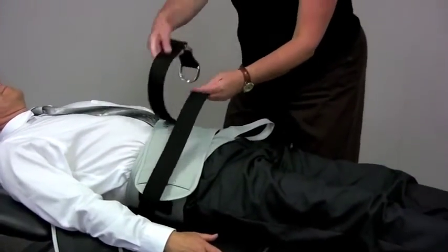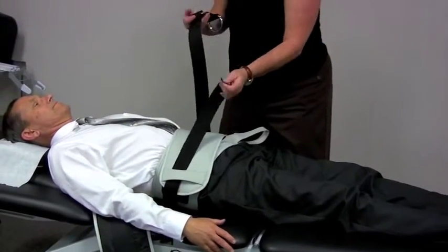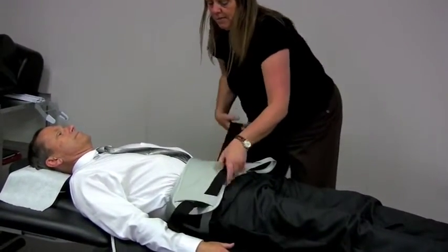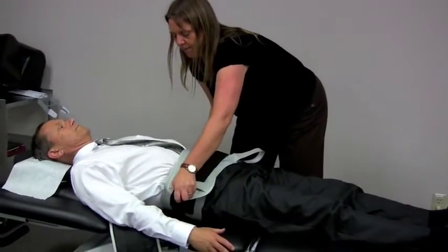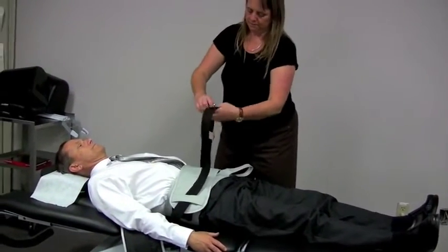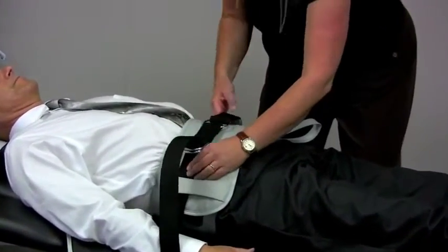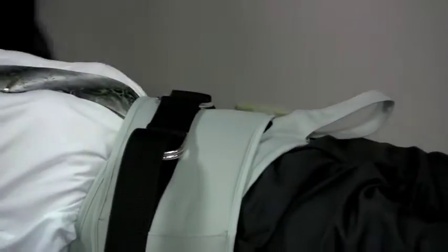And then this next part, it's optional to place this part through the slot right there. You don't have to do that. And I don't want to jostle him too much, so got to be careful thinking about patients who have this done, as they are going to be in perhaps a back spasm or have some disc involvement. And I'm going to go through this buckle, and my goal is to have this ring in the center. So I have to keep switching it around a little bit more. Now I'm going to come to this side here to pull it tighter.